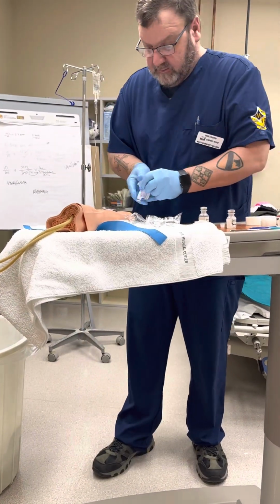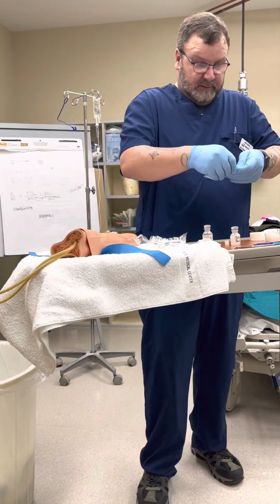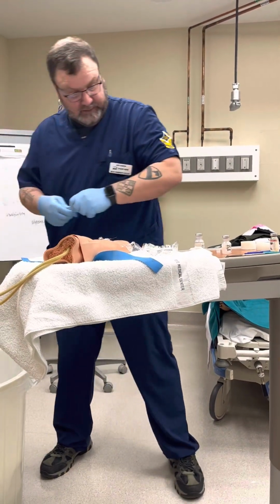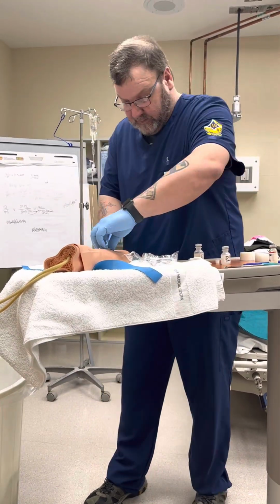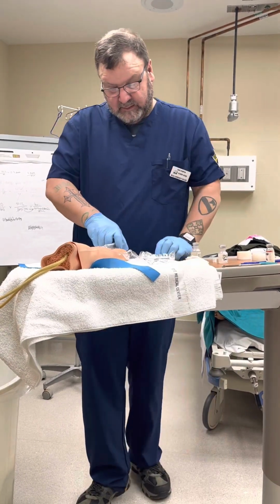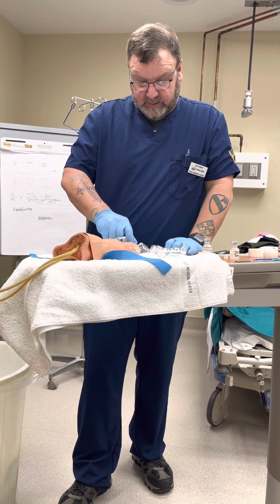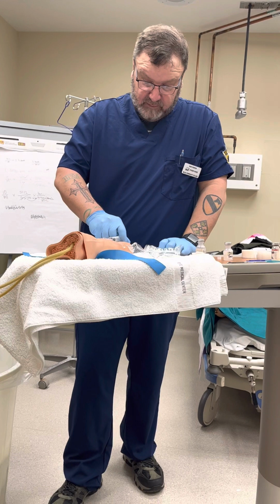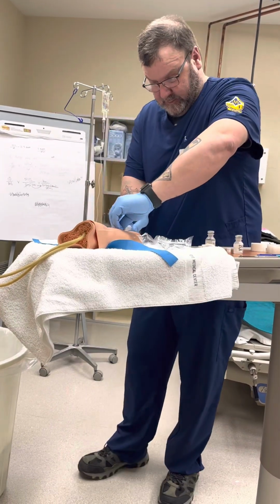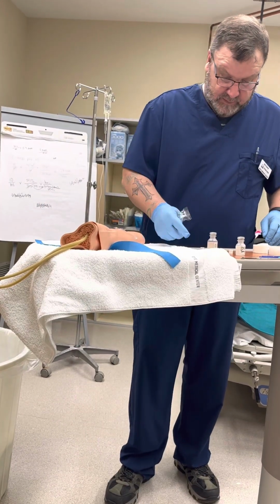Take another alcohol wipe, clean that off, take my flush, assessing my patient, reaction to medication, everything's beautiful. I will now flush 5 milliliters slowly and appropriately. Boom. So we are done.